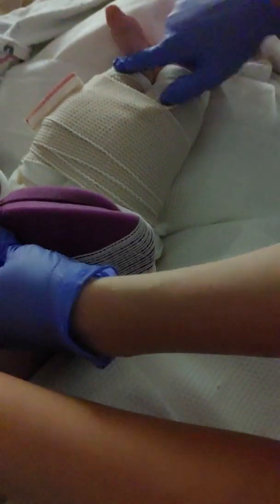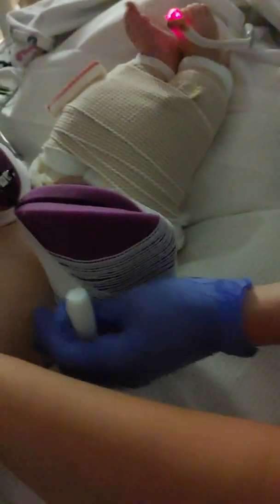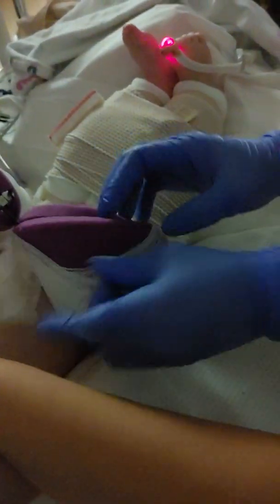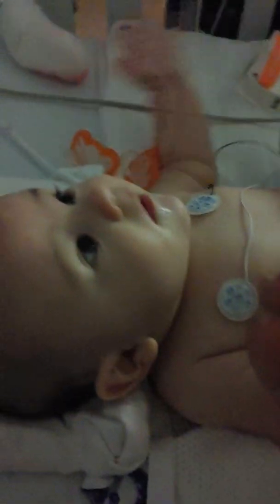So yeah, I think just keeping an eye on this wrap and I just don't want it pressing down at his feet, but I love to let his feet move a little bit. So if we can get away with it, awesome. As you can see, he clearly loves to move his feet around too. So if we can keep it from sliding down, then we can give you your feet back. As long as you don't wiggle your legs out.